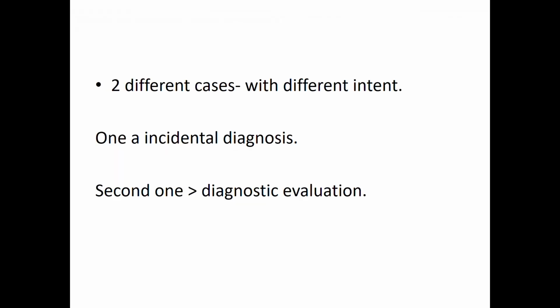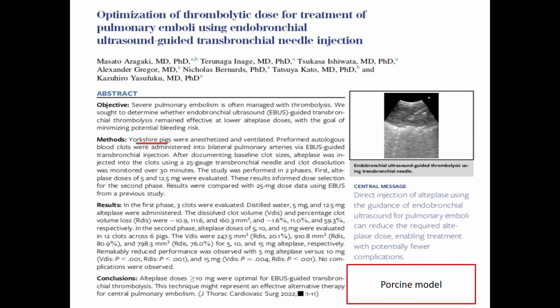So, 2 different cases which I showed you with different intent: one an incidental diagnosis while doing a different procedure, and the second one done with a diagnostic intent. Now, whether it has any role in pulmonary embolism therapeutics, by therapeutics I mean post thrombolysis. Whether your thrombolysis has worked or not, whether we can monitor this also with EBUS.